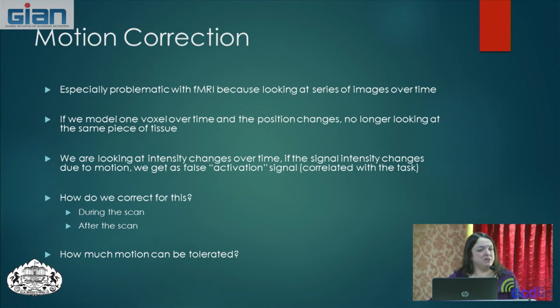But what they actually found is that if you try to put somebody's head in place with something hard and hold it into place, and you put them in there for an hour or more, it starts to become really uncomfortable. So they're trying to move around to adjust for being uncomfortable, and it actually can cause more motion, even if it's in there pretty tight.